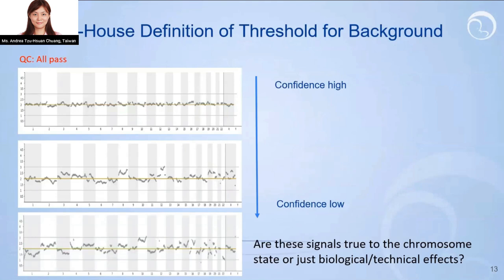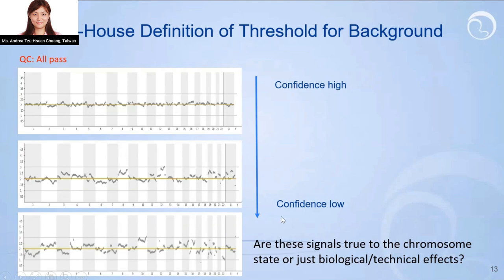Besides the mosaic system, another issue is the threshold for background noise. Most PGTA users choose commercialized software for analysis because manufacturers provide fixed QC values, and the procedure is simpler and faster. However, you may find some samples where all QC parameters pass, but the pattern is still very divergent and very noisy. That means the confidence for mosaic calling is reduced, because we won't know whether signals represent true chromosome status or biological and technical artifacts. For mosaic calling, both the calling criteria and the calling conditions are very important. In some conditions, mosaic calling may not be workable — you should simply distinguish euploid from aneuploid.